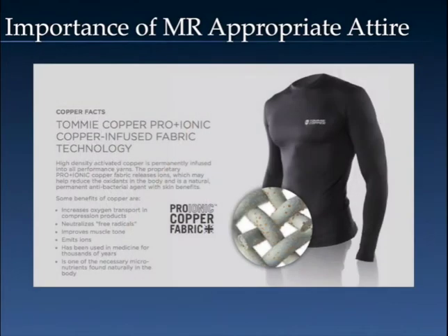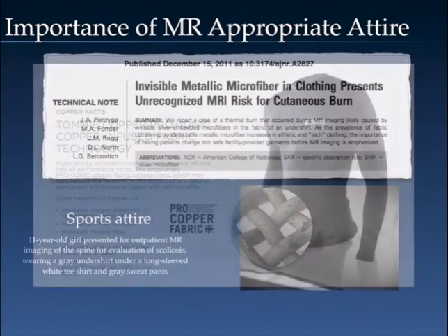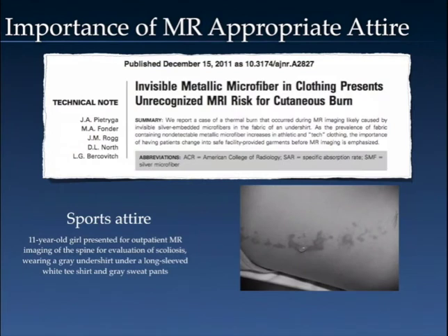I think most people are pretty aware that the tech clothing, Tommy Copper, Under Armour, Lululemon, just trying to think of some off the top of my head, these types of clothing is very common for them to have metallic fibers or invisible microfibers that, again, are metallic. And there have been several reports of these heating. In fact, here's one. This is a report from 2011.